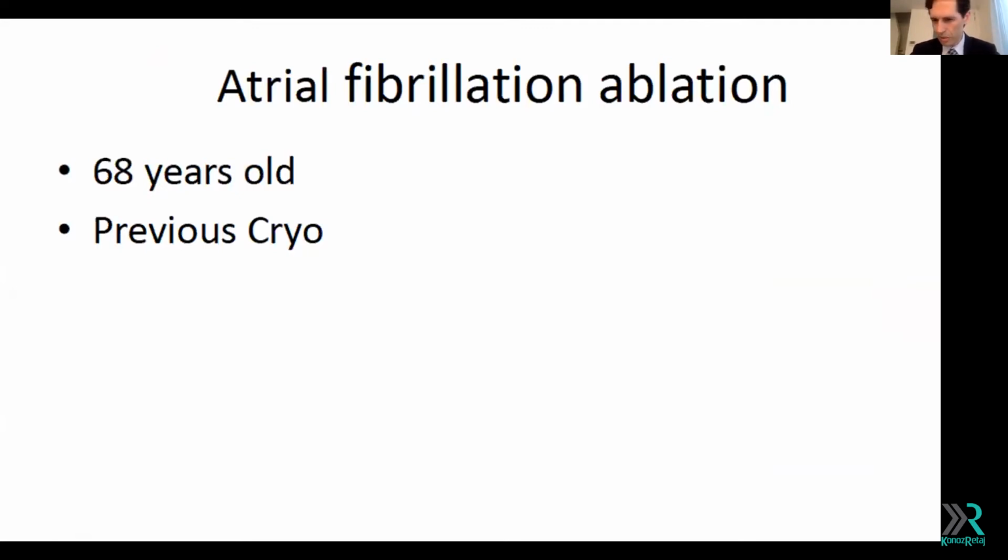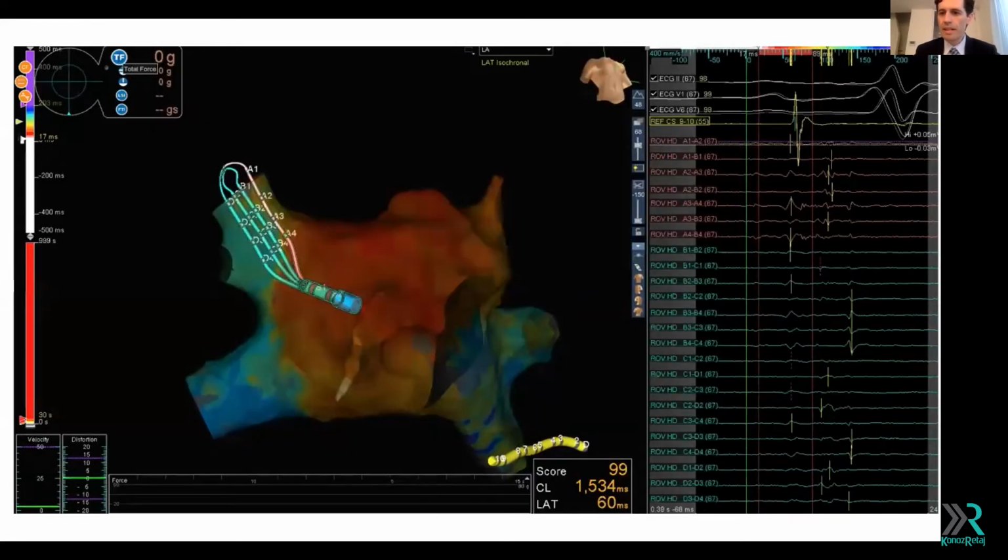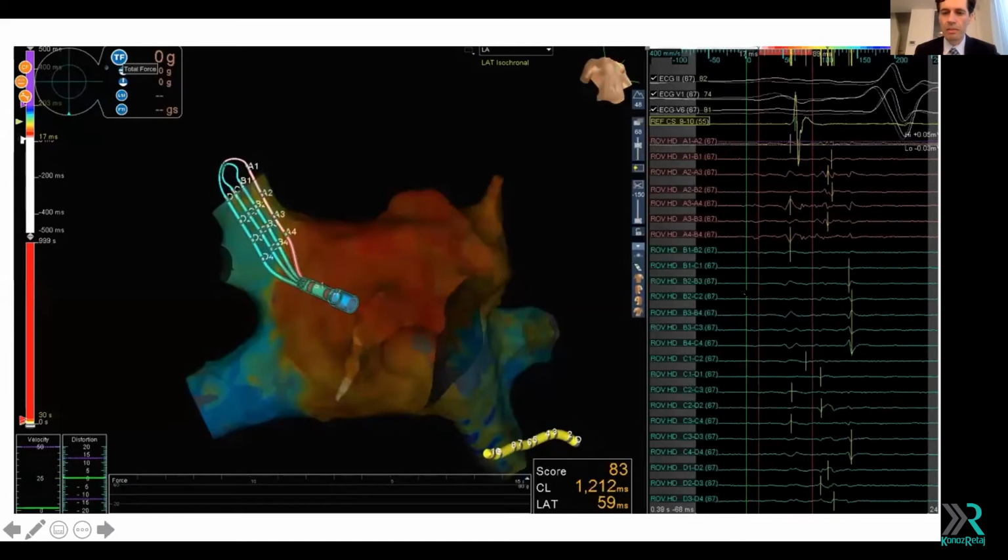That is what we are doing mostly here in Belgium and in Europe: atrial fibrillation ablation. More than 60% of our activity is AFib ablation. And I think that the high density grid has an added value, because we are able to identify the gaps quickly when there has been an ablation in the previous period. And this is an example that I would like you to see.